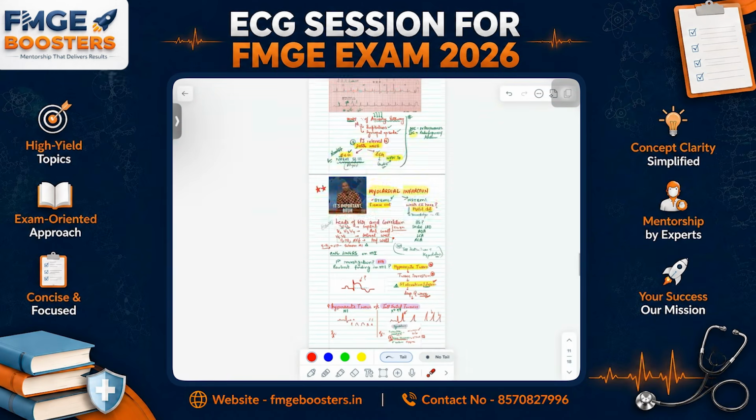Doctor, in posterior wall MI, we have to check for the reciprocals. हाँ yes, उसके लिए we have to use that V7 leads also. But अभी तक, to be honest, they have never asked about that. The maximum they ask is about inferior wall MI only. ठीक है, आज I didn't cover because I think we are very much near to examination, so it was not that much important to cover इतने ज़्यादा complex topic. ठीक है, that's why I didn't.